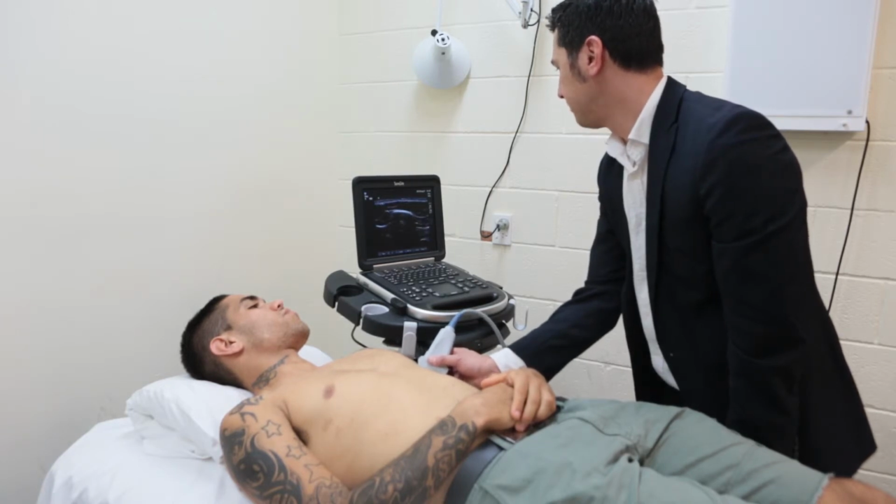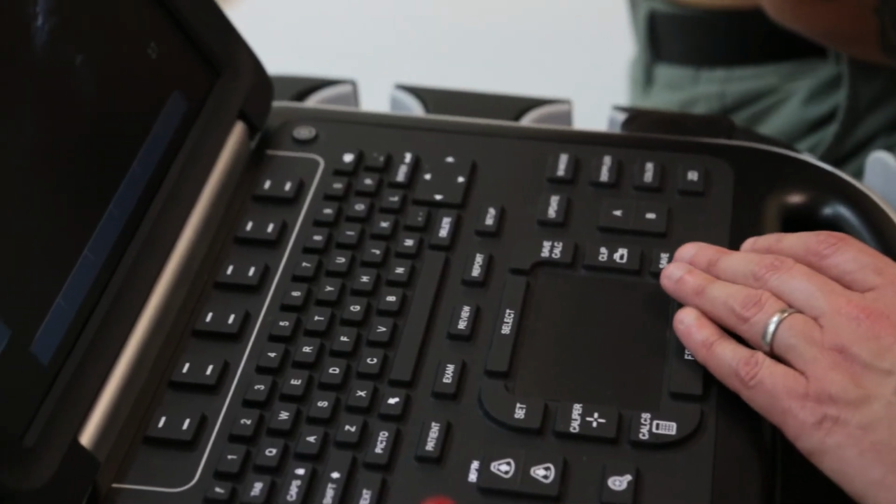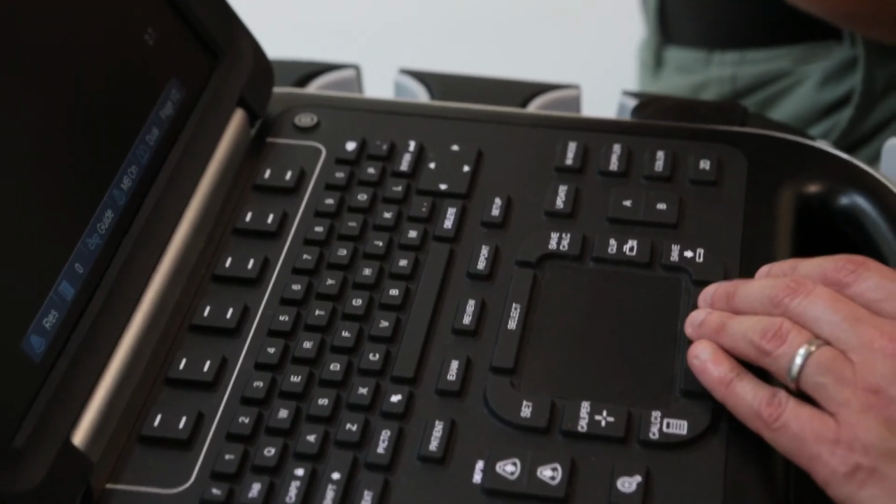chest wall muscles. The system also allows us to perform match day diagnosis, so we're able to ultrasound the patients or the players in the treatment rooms and make a quick assessment and tell the coach whether the player is suitable to get out onto the field again. And if that's the case and the patient needs some treatment, we're able to intervene at the time to allow them to perform at their best. And that's usually with a local anaesthetic injection.